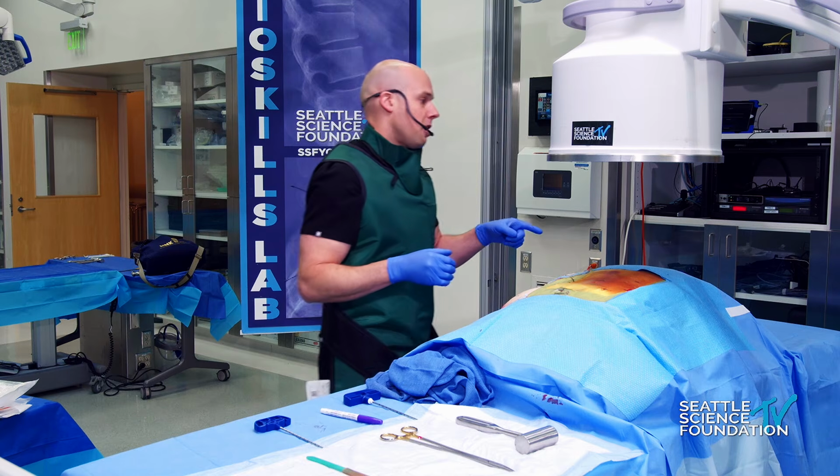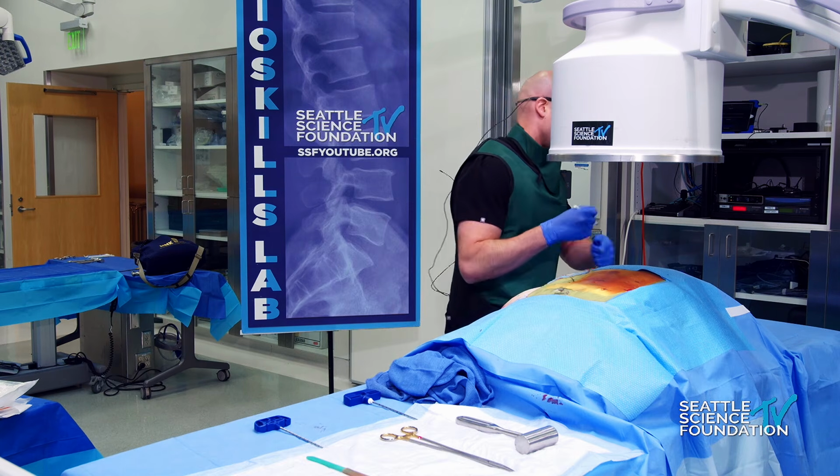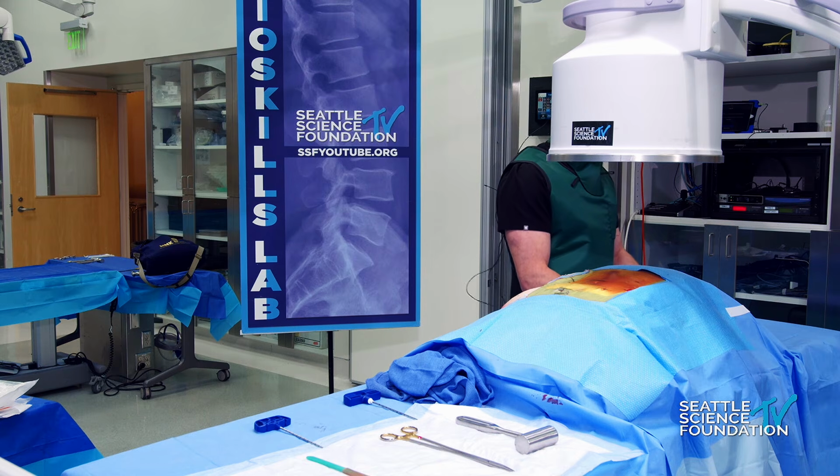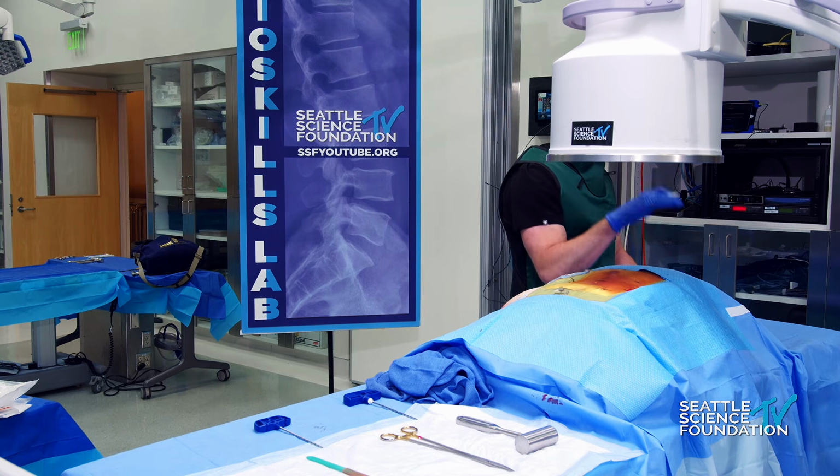If we can just come here at the head, there are different types of techniques that can be utilized to access the vertebral body. Often we know about the transpedicular approach. So you will have an AP. You start with an AP view of the C-arm.